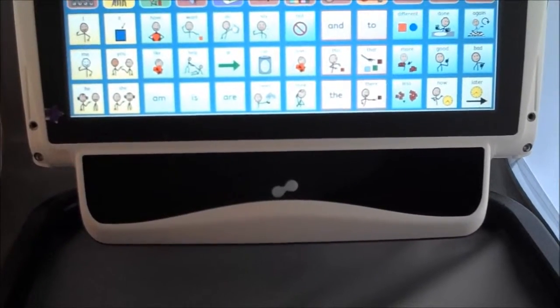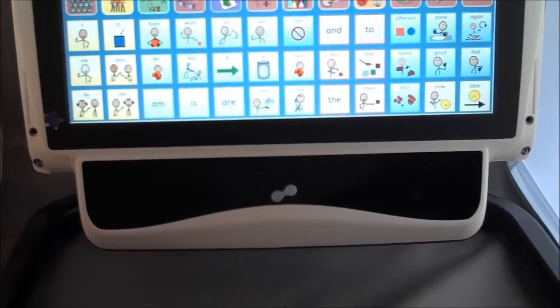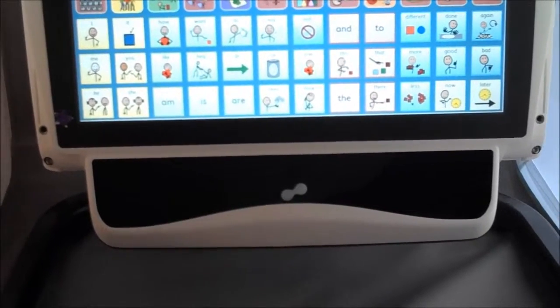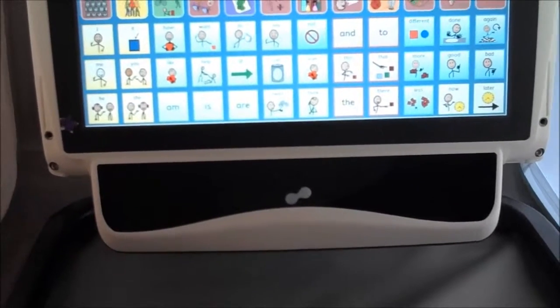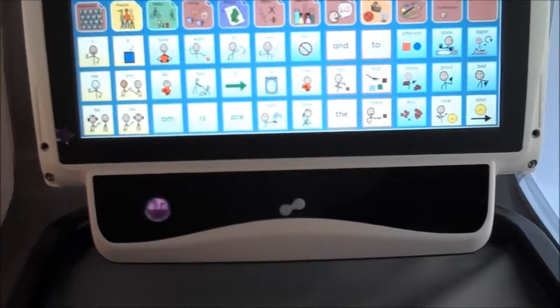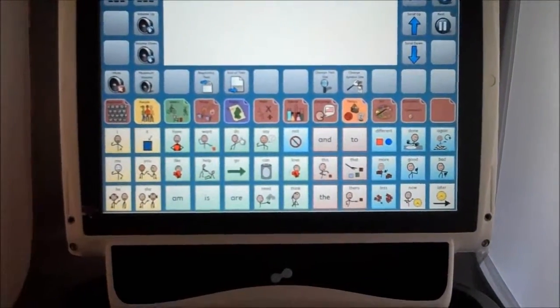The cameras look for the reflection of that infrared light off of the back of the retinas, and then the computer does a whole bunch of Euclidean geometry and other math to determine where the user is looking on the screen, and now you can use your eyes in a similar way that a mouse can be used.